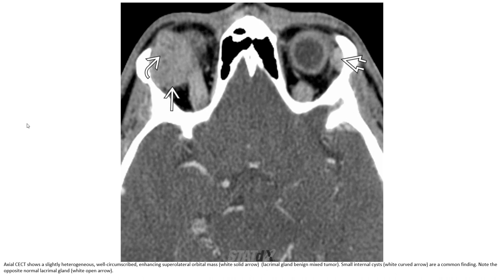The axial contrast-enhancing MRI shows a heterogeneous, well-circumscribed enhancing superior lateral orbital mass, indicated by the white arrow. The lacrimal gland is displaced. Small internal cysts, indicated by the curved arrow, are a common finding. Note the contralateral normal lacrimal gland, indicated by the white arrow on the opposite side.